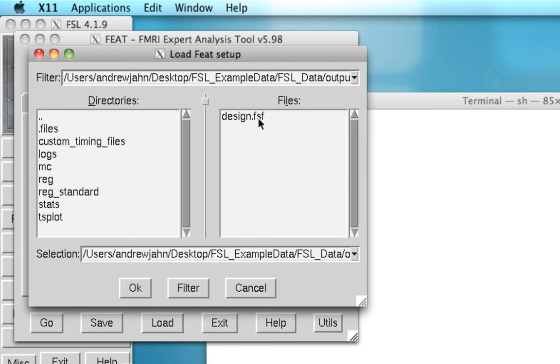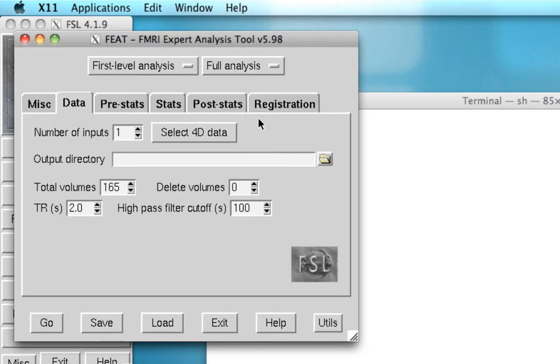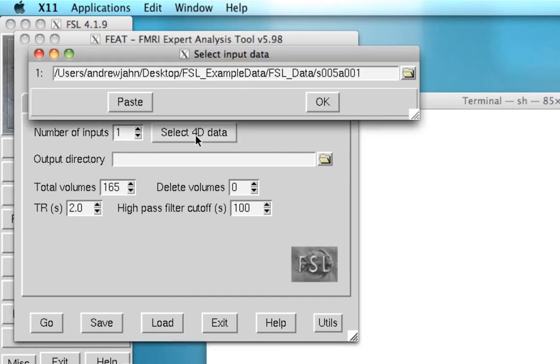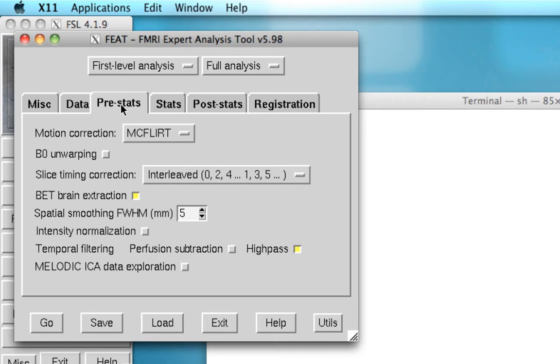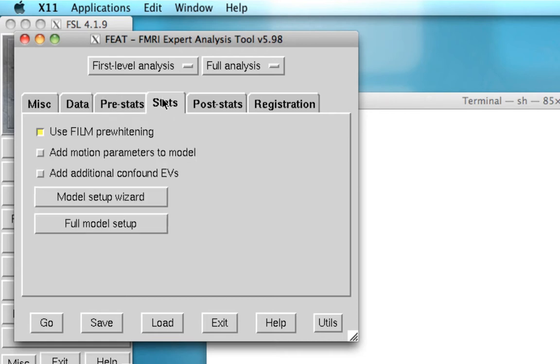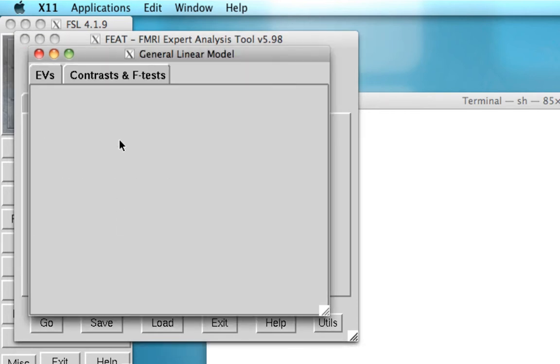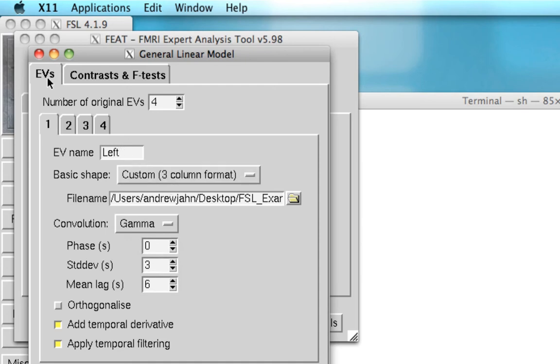If I double click on that and load it, you notice that everything that I did in the first run has been automatically loaded in here. All of my options, all of my text files, everything.